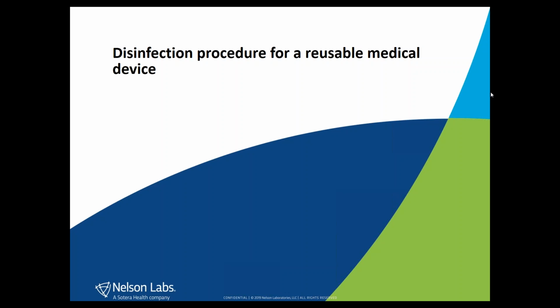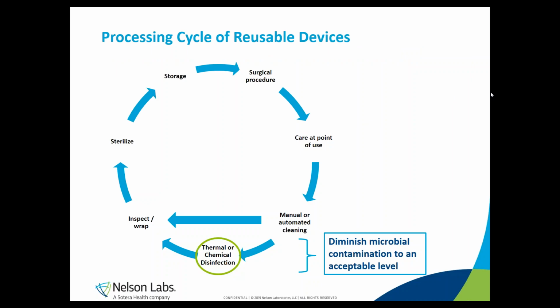So Melissa, can you maybe explain what will be taken into account during a disinfection procedure of a medical device? Yes, of course, Stephanie. First of all, I want to highlight the significant difference between the process of cleaning and the process of disinfection. As Stephanie already explained before, cleaning is the process of removing contamination, such as residues of blood, other patient-derived debris, and germs from all surfaces, holes, and lumens of the device.